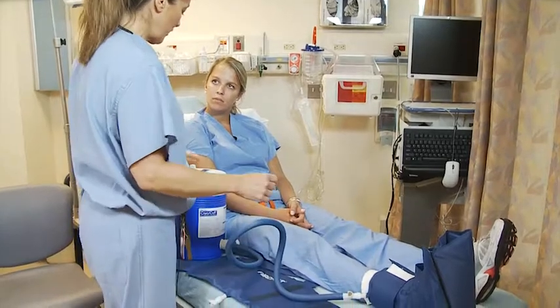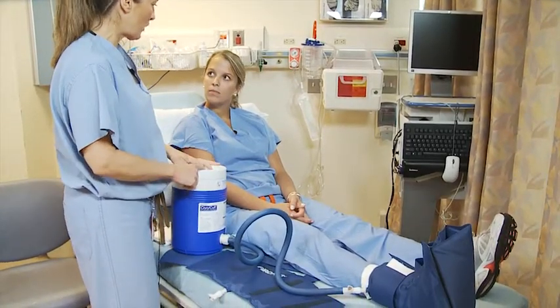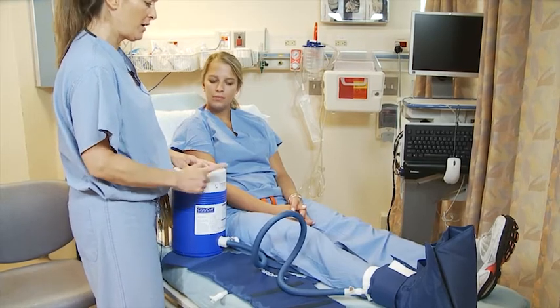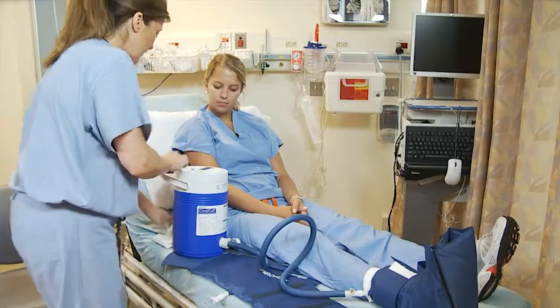Once done, you want to exchange this about every 30 minutes while you're awake, especially the first 48 hours. But when you're asleep, if you wake up, you can exchange it. You can either leave it connected or you can disconnect.